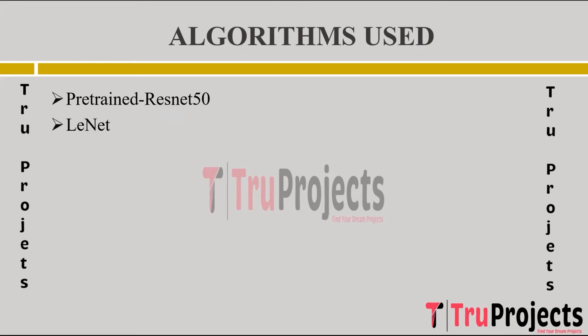LeNet. LeNet is one of the early CNN architectures designed by Yann LeCun for handwritten digit recognition. It consists of multiple layers, including convolutional layers with subsampling and fully connected layers. LeNet is utilized as another CNN model for the diagnosis of Alzheimer's disease. Its architecture helps in learning intricate patterns and features within the select slices of MRI images, aiding in the classification of different stages of the disease.